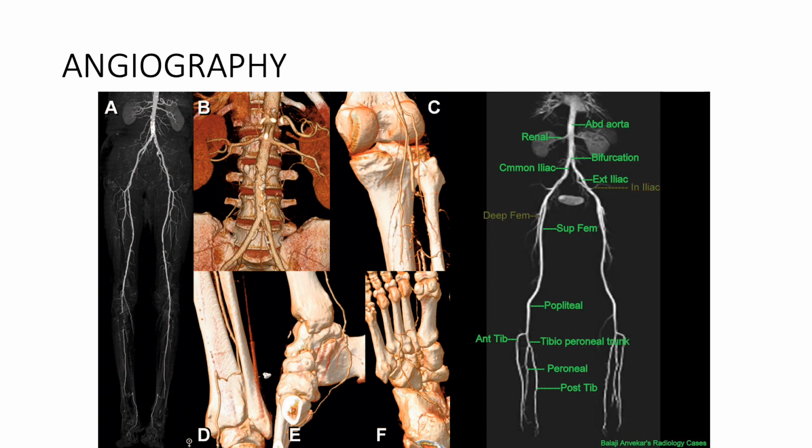You may also be able to distinguish the vascularity of a particular cancer affecting a particular limb. So you may be able to plan out the surgery or whether you would opt for treatment by interventional radiology. You know.